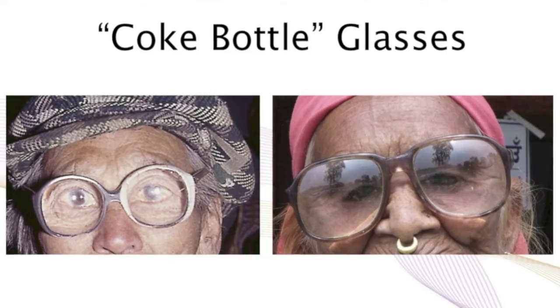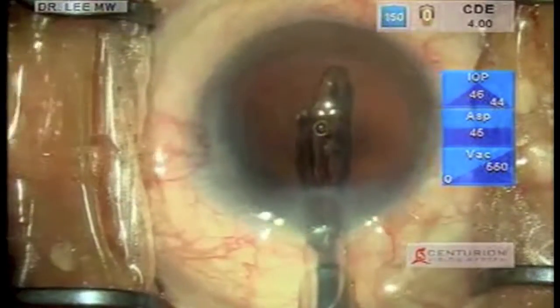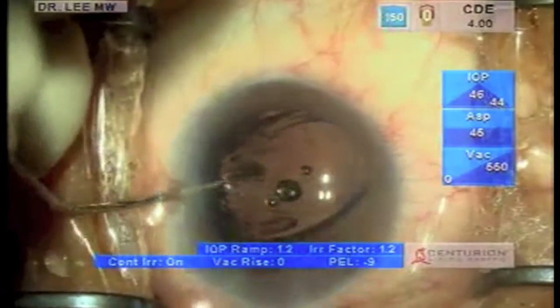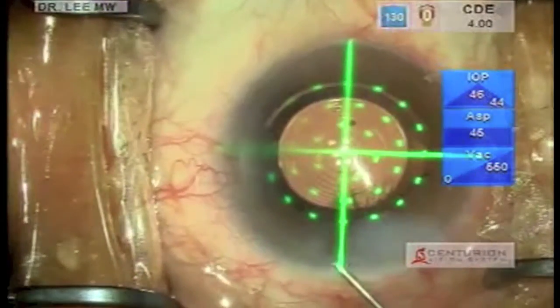Visual rehabilitation after cataract surgery has also moved on from the use of aphakic glasses to modern-day intraocular lenses to provide spectacle freedom. This video presents some of the challenges faced with the use of intraocular lenses and provides a step-by-step guide to management.